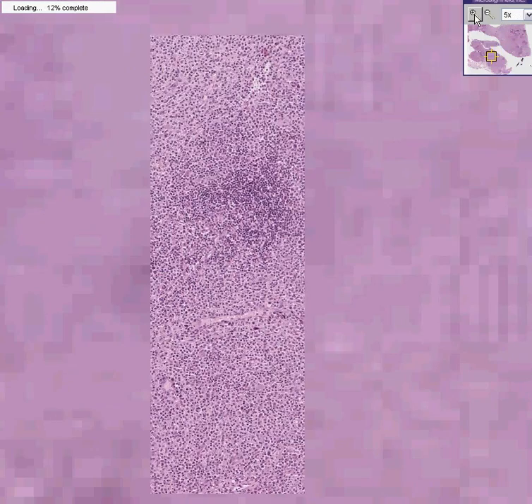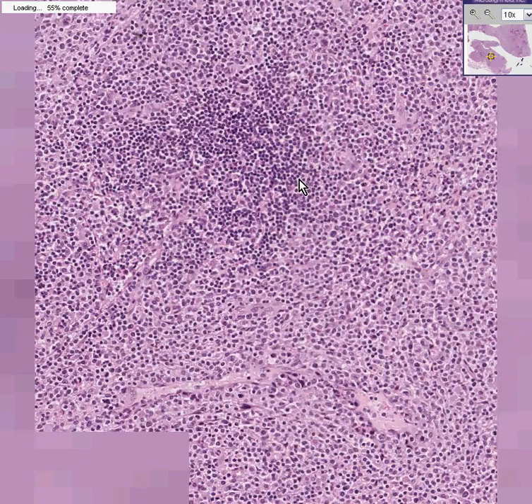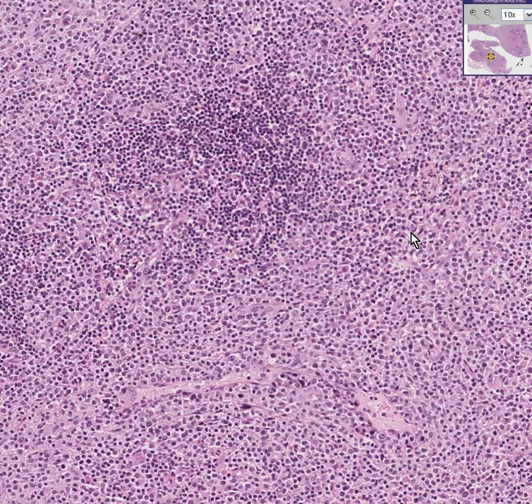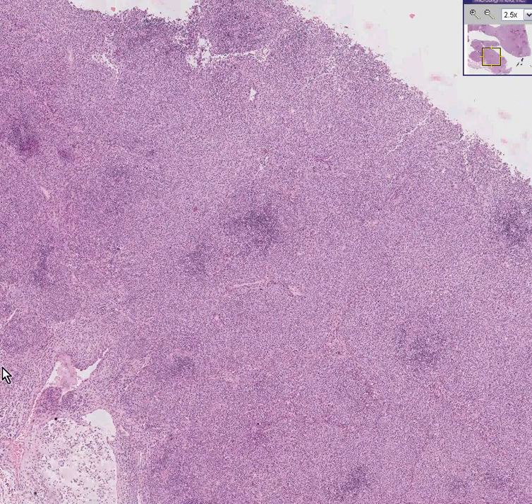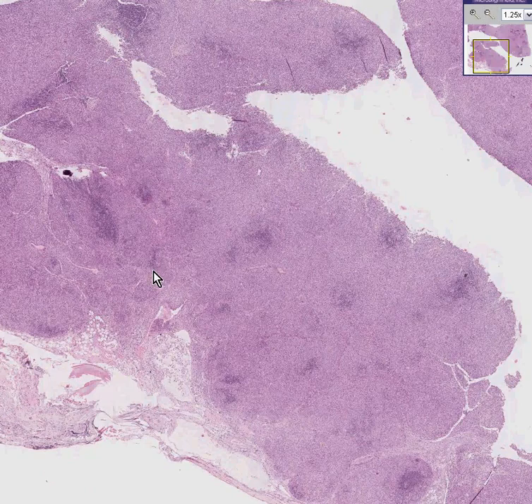The majority, however, looks like lymphocytes — perhaps not so small, perhaps not so well-differentiated, perhaps larger, perhaps more cytoplasm. Most importantly, these are all lymphoid cells, and the architecture of the normal lymph node is completely effaced. There's no differentiation of follicles towards the periphery, and cords and sinuses in the middle.